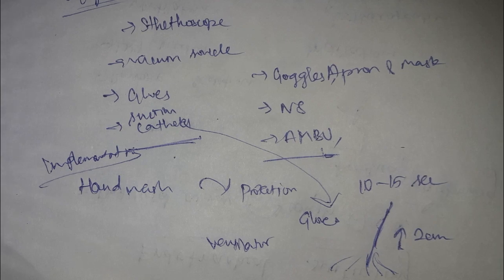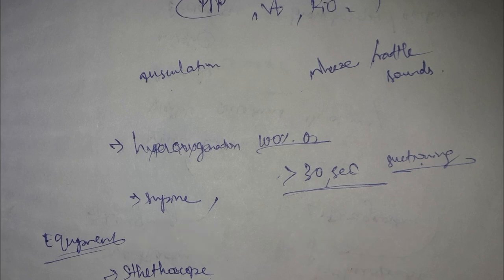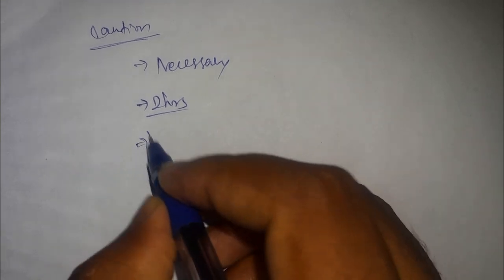After the procedure we have to ventilate the patient again, give the oxygen source to the patient, and document properly. If nurses are there, they have to document. It is not a routine process; it is done only when necessary. If the patient is bedridden, we should monitor once every 2 hours: is there any blocking, any secretion? Like that we have to notice. It is a harmful procedure, so if we make a small mistake, it also leads to a greater problem.